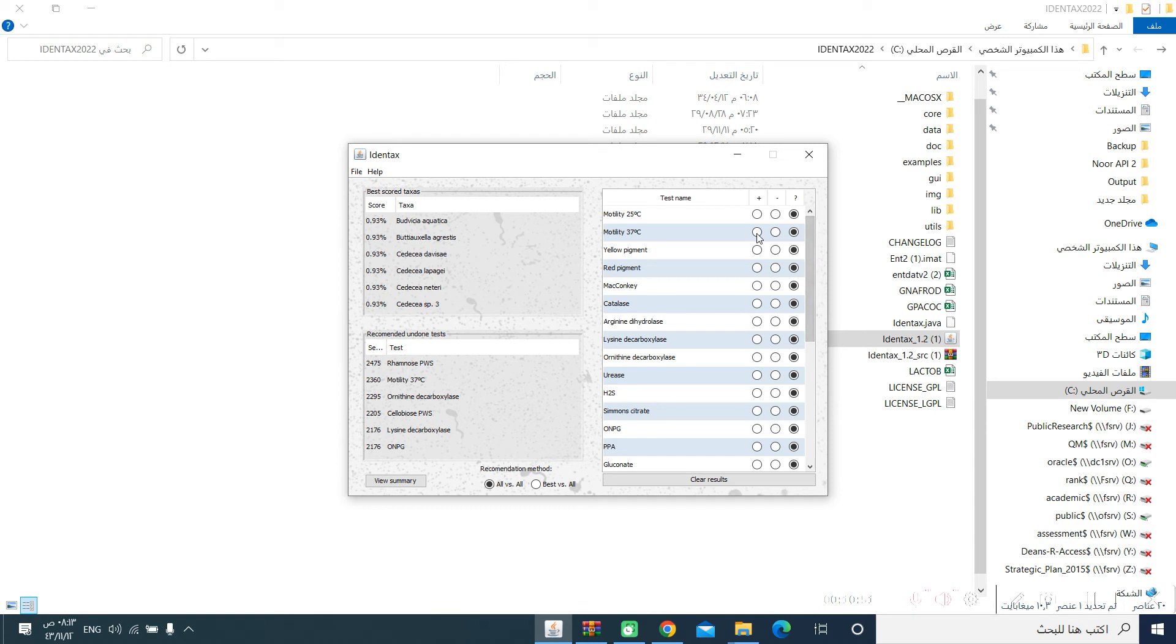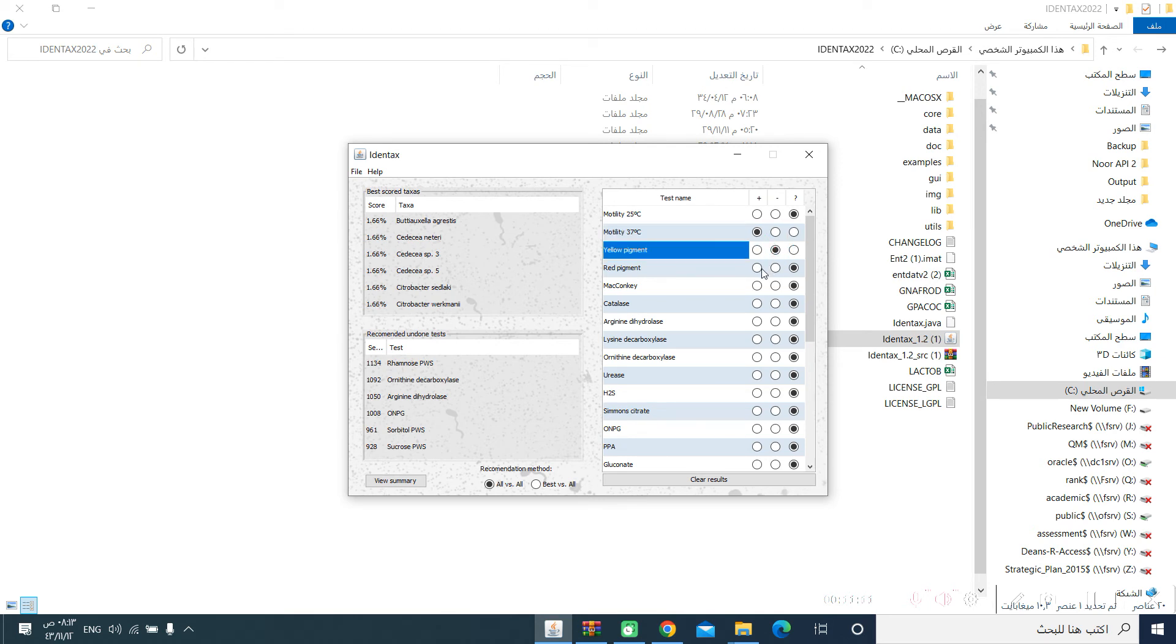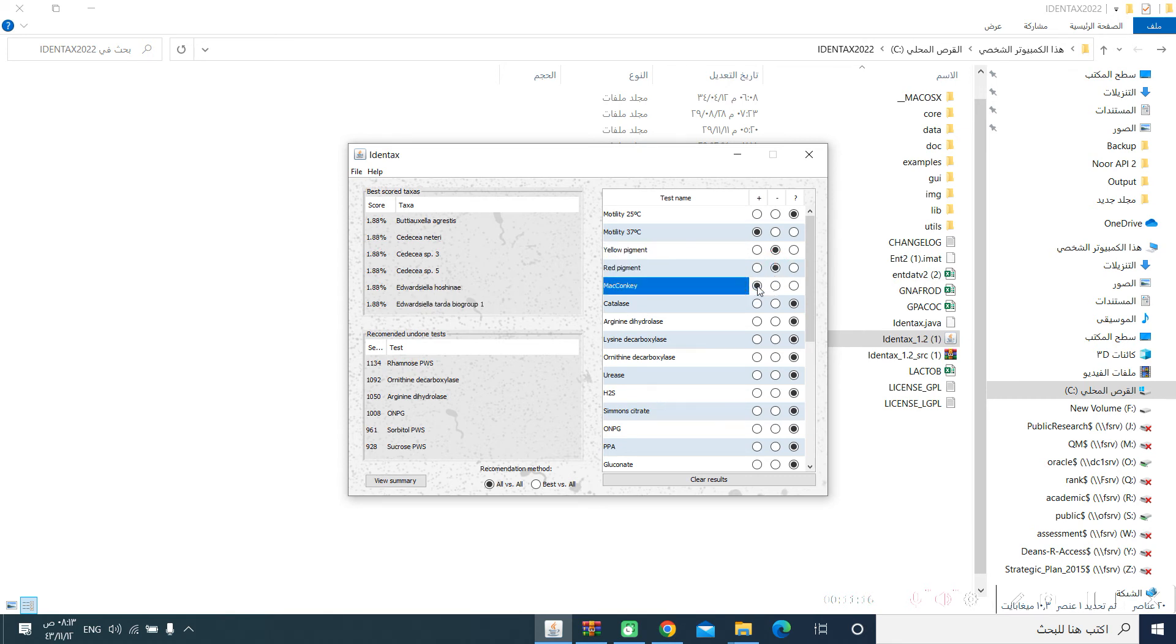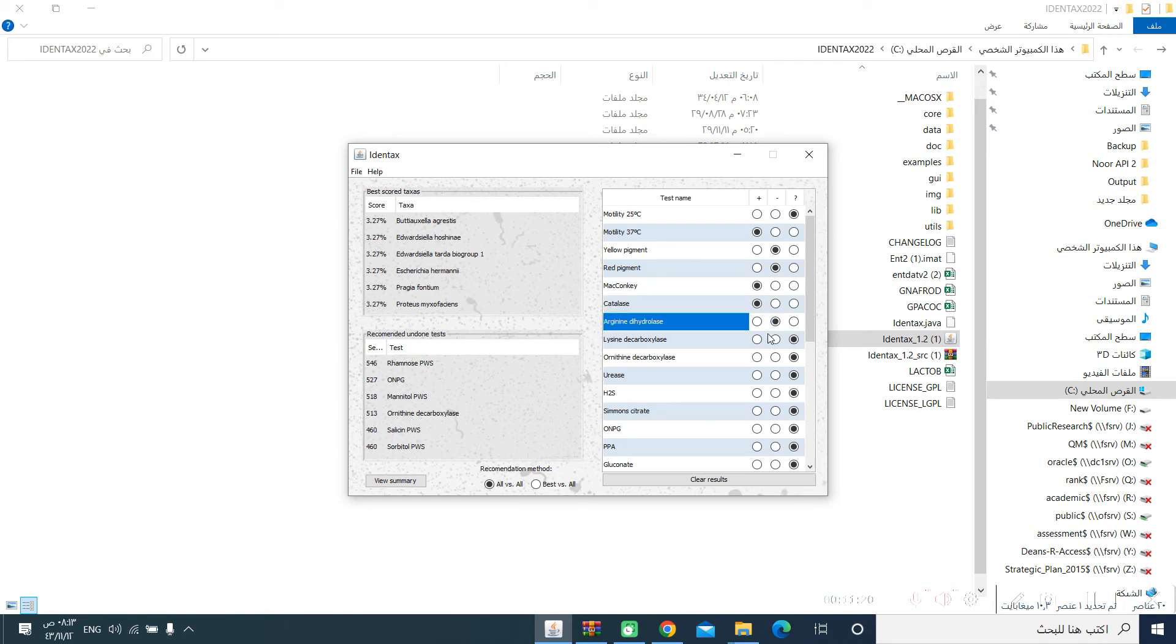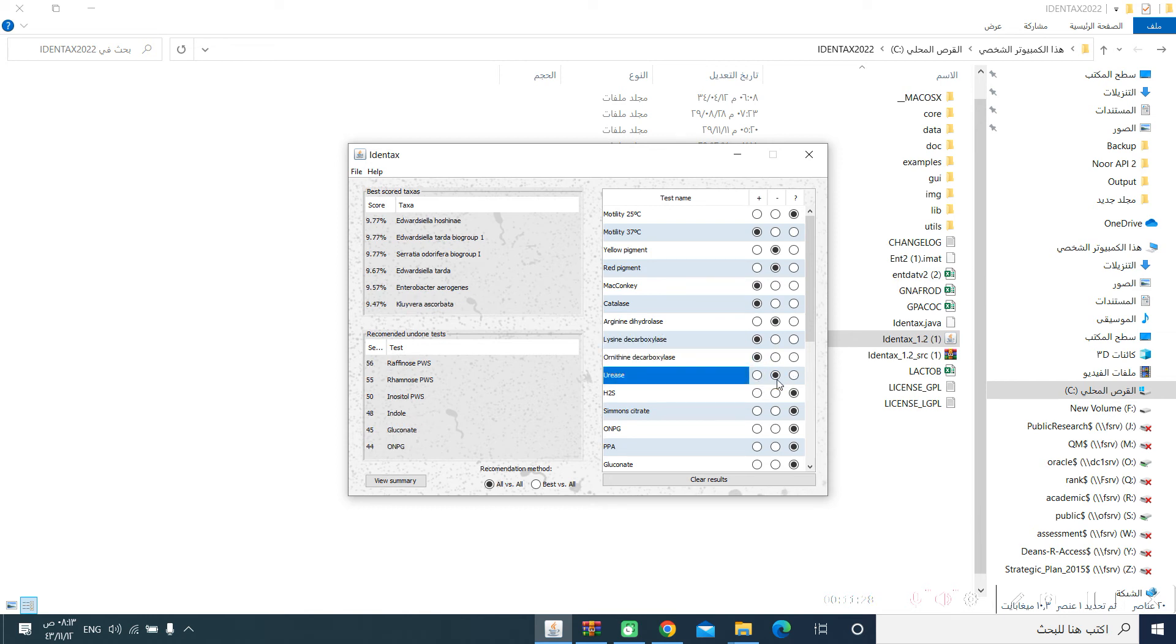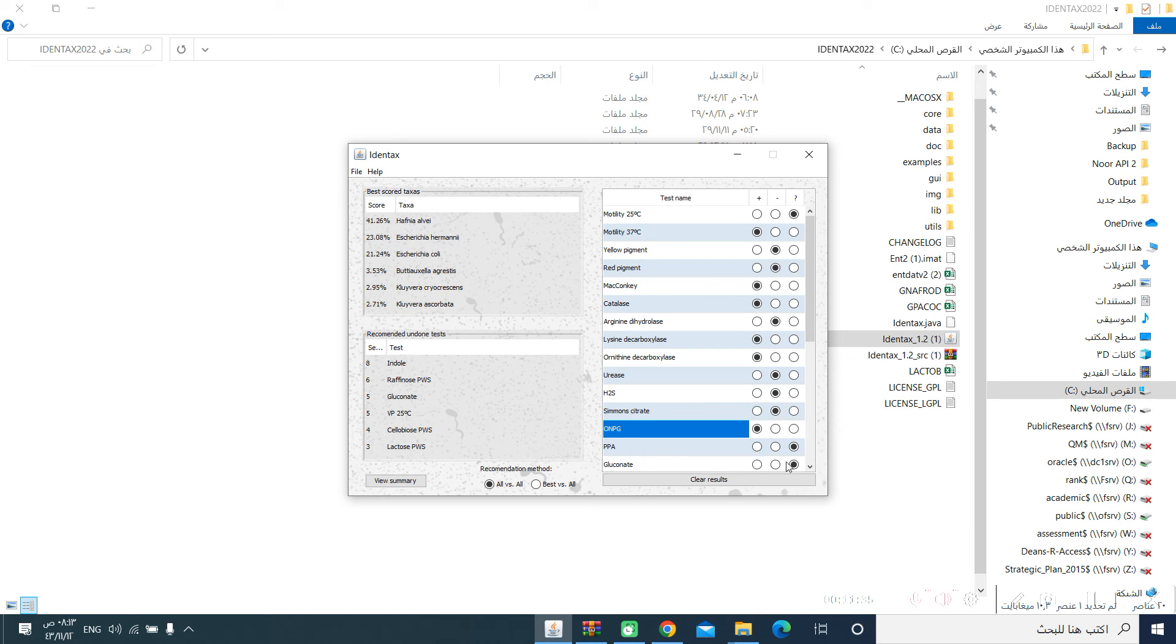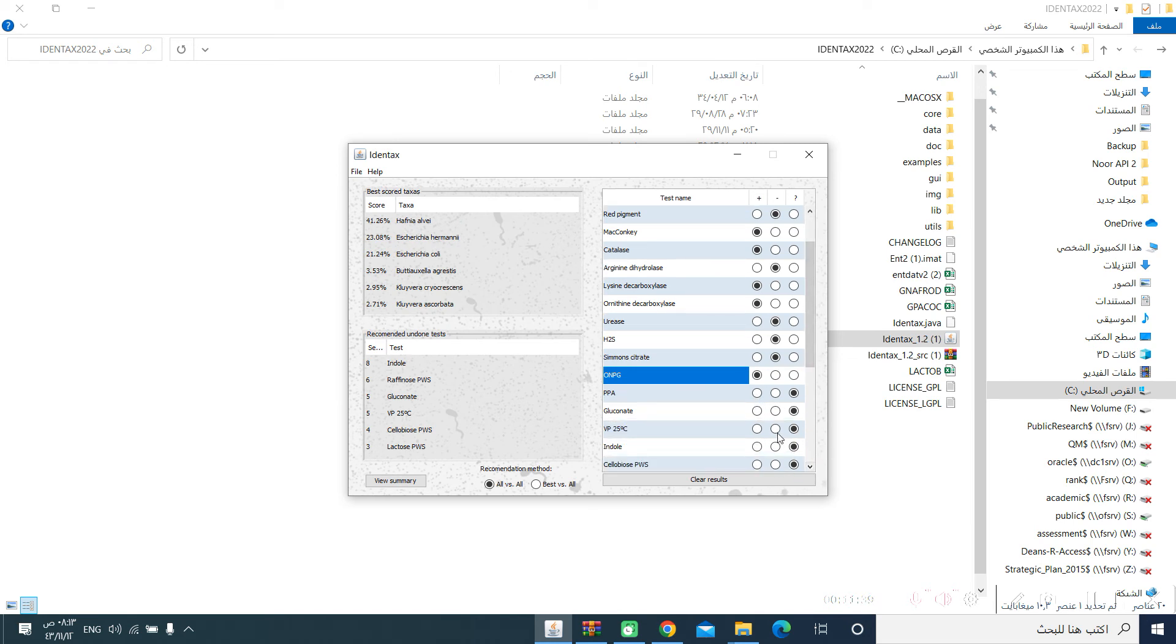Let's say you have performed only the motility at 37 degrees, but you did not perform it at 25. So, you will say it is unknown, and this column will be checked. You did not notice any yellow pigment, so it is negative. You did not notice any red pigment, so it is negative. It grows on MacConkey, yes. Catalase, positive, yes. Arginine dehydrolase, let's say negative. Lysine decarboxylase, let's say positive. Ornithine decarboxylase, positive. Urease, let's say negative. H2S, negative. Simmons citrate, also negative. ONPG, positive. PPA, not done. VP, not done. Indole, positive.